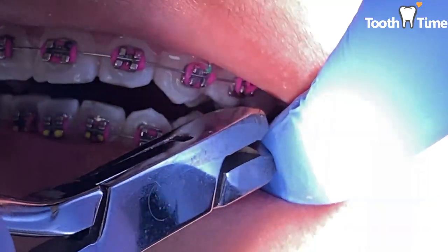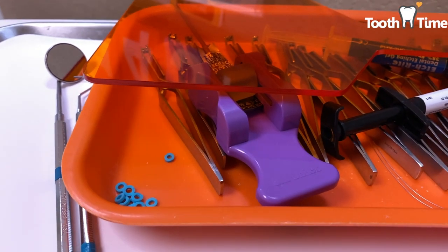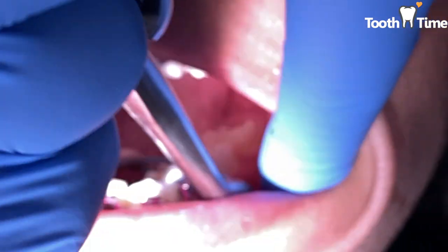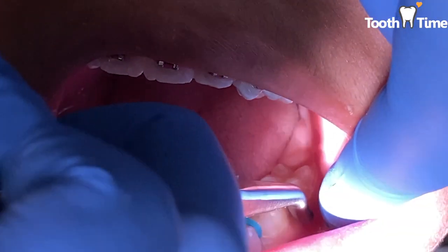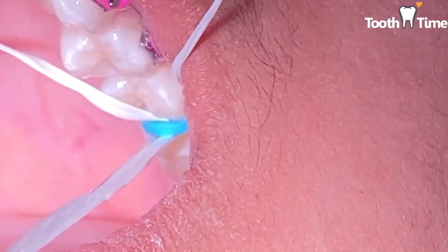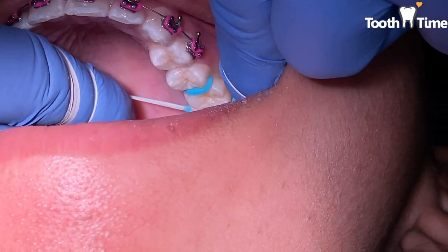Our final part is placing the spacers. Spacers are bright turquoise thick rubber bands that we place in between the molars and between the molar and premolar. That helps create space to place the molar bands at the following appointment. They're usually left on for about a week. There's a super cool video about spacers — click the link above. Remember, these spacers are not comfortable.